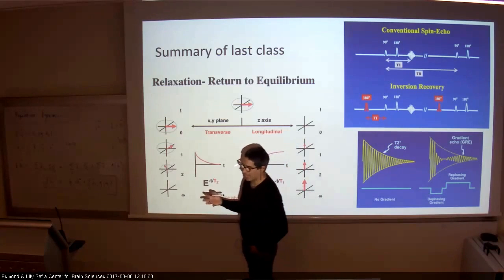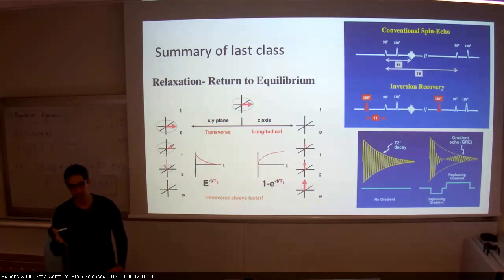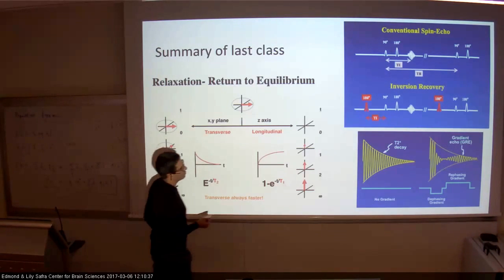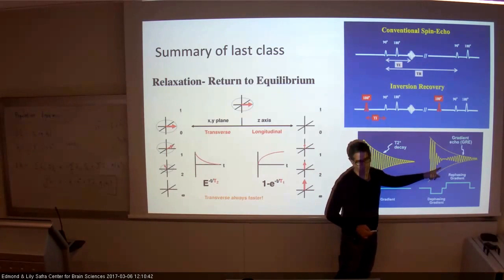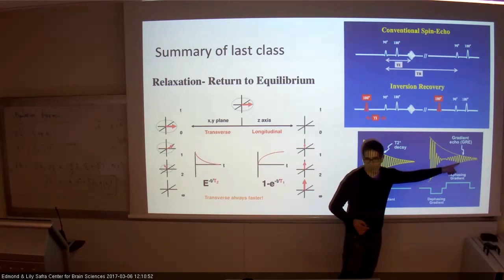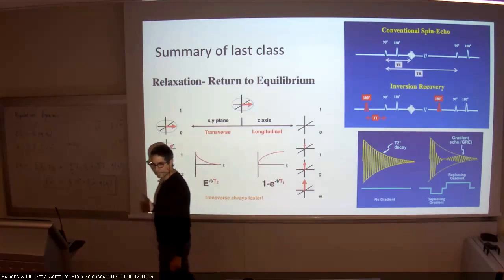That's an additional small magnetic field on top of the main magnetic field. A variation in the magnetic field in space we call a gradient, and this will create even greater signal loss, a strong dephasing. And if we redo this gradient to rephase, essentially making the effect go the other direction, we're going to get an echo sometime after TE. So that was a gradient echo sequence.